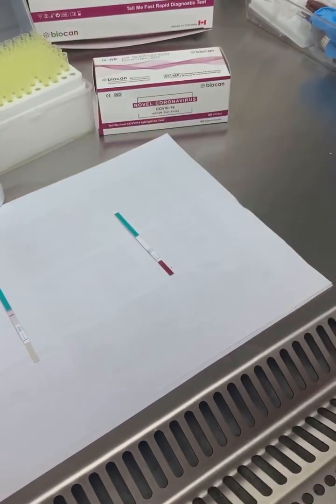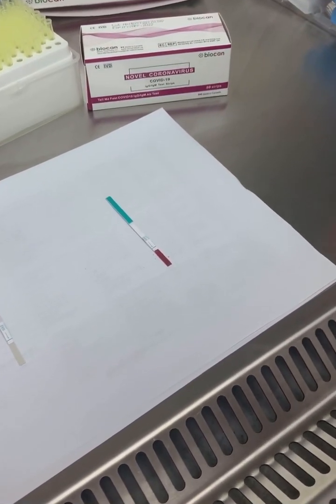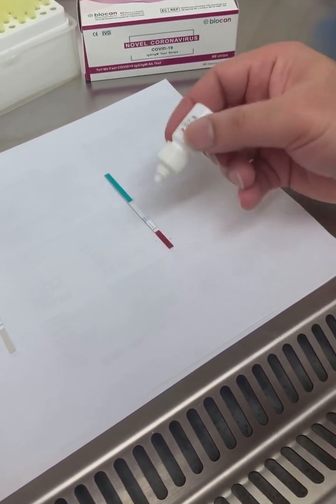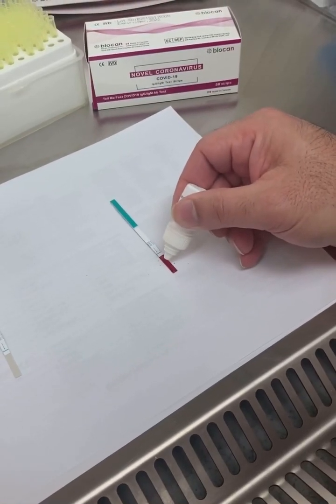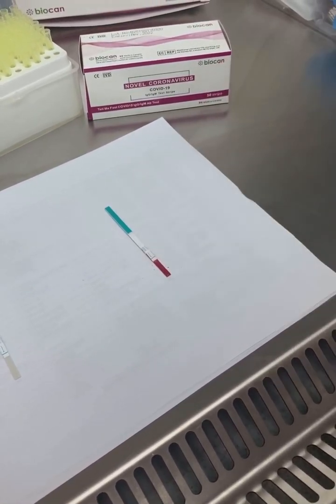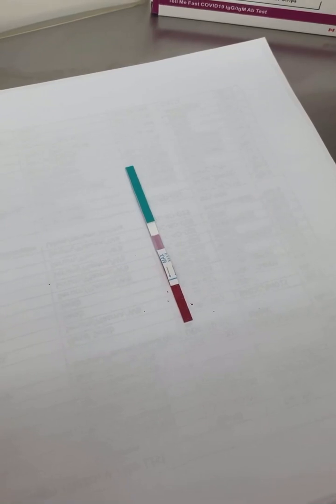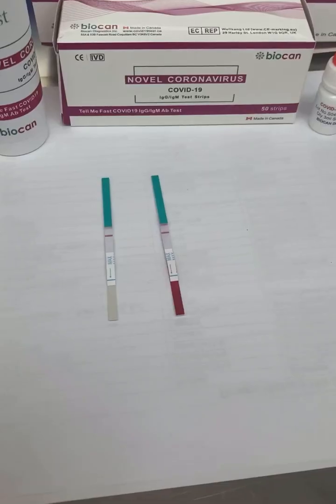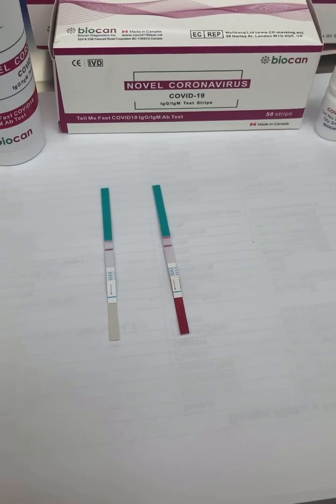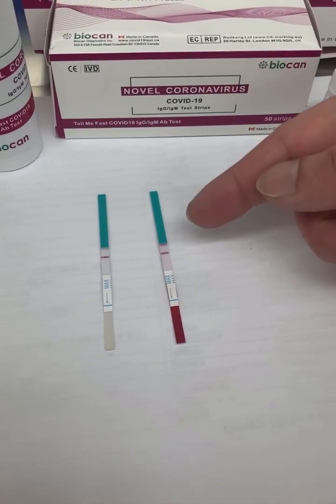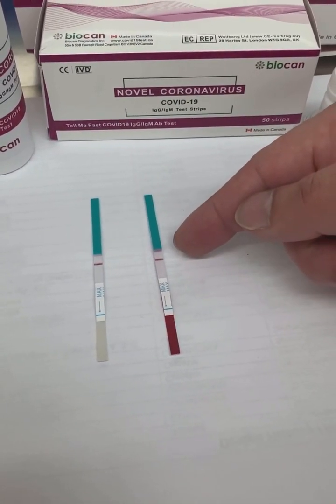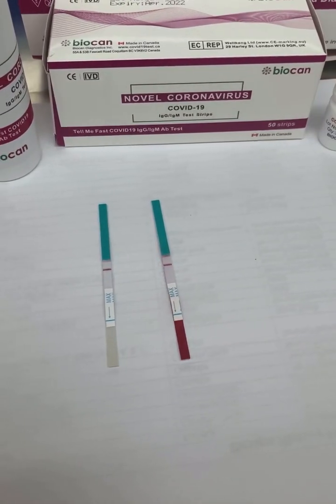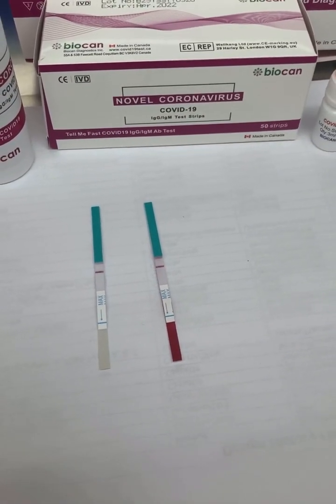Now add two drops of the buffer to the sample pad. As you can see, the sample is flowing through the test strip. You can read the test at 10 minutes. One line in the control area indicates that the test is negative. There is no IgG-IgM COVID-19 antibodies detected.